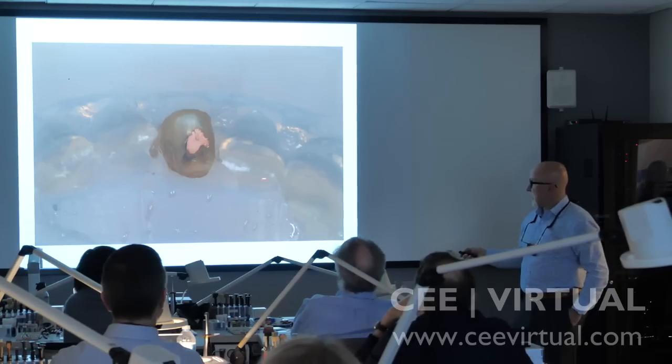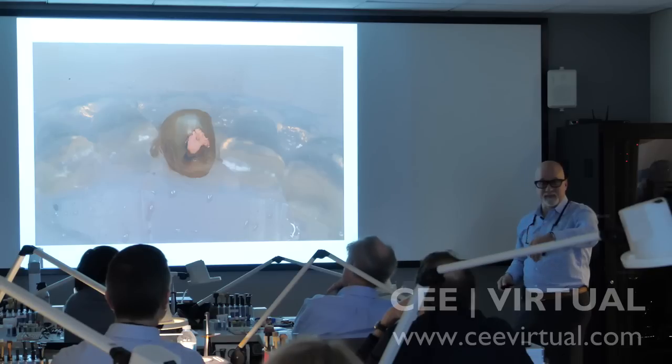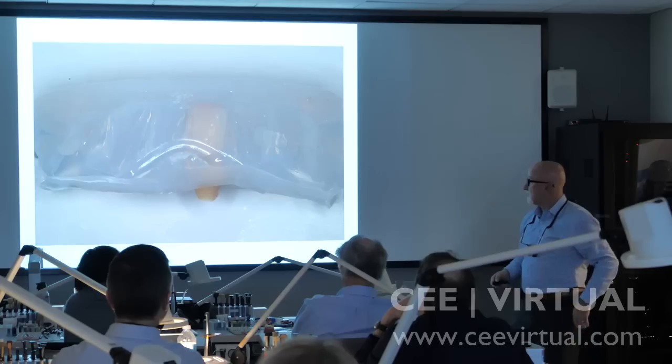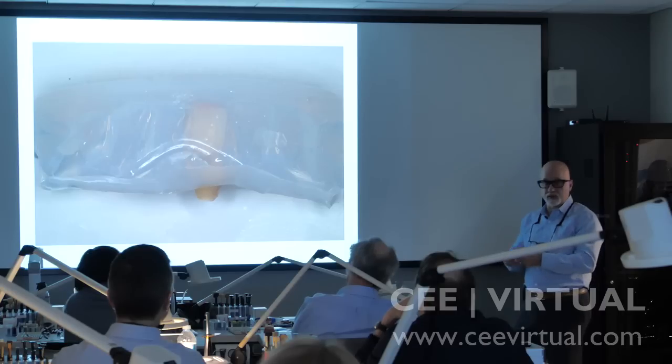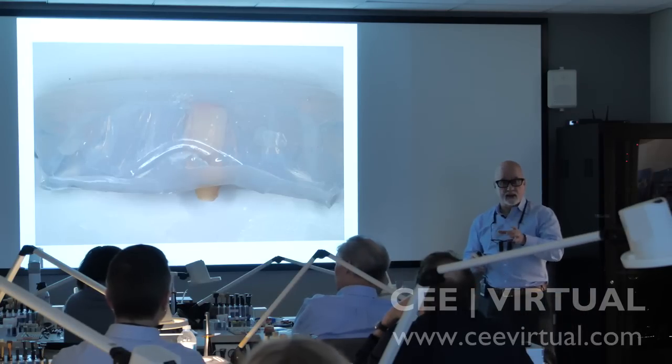But this is adapted well to the lingual, and because it was perfectly made, you have to remove some of that. So this is how it looks. This is a very strong durometer material that is not flexible. We're going to be using this tomorrow when we make our overlays.